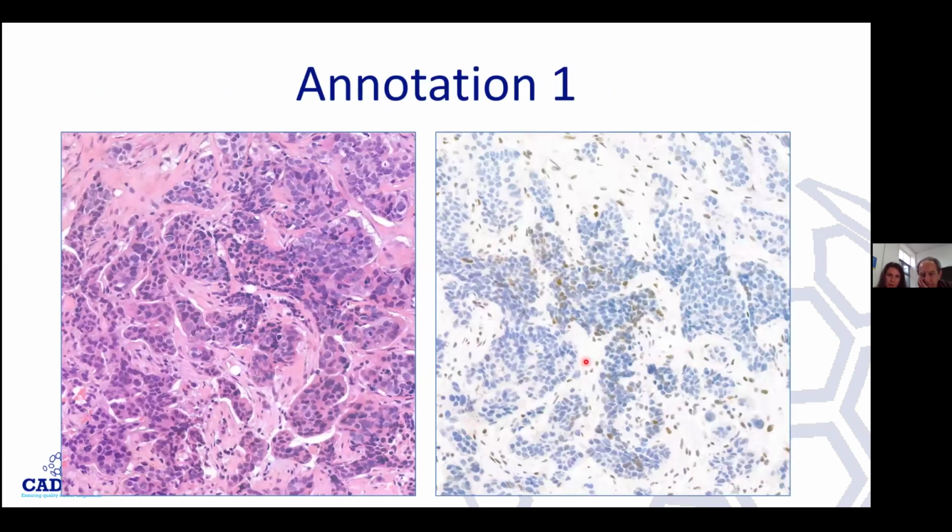The first one, I think we can all agree, is a wild type pattern. There's internal control. There are cells weakly to moderately staining. But when I looked at this picture, the staining intensity of these cells is such that one almost says, is it real staining? Because I think some of them are beyond that.